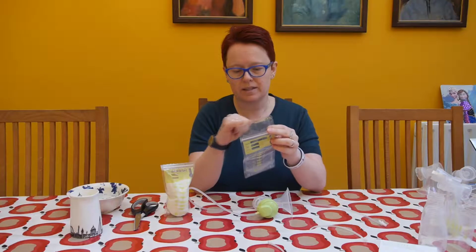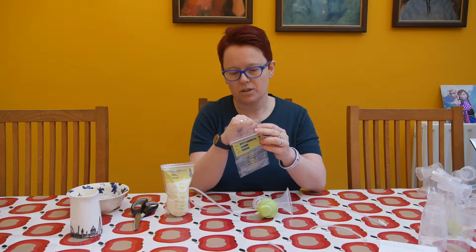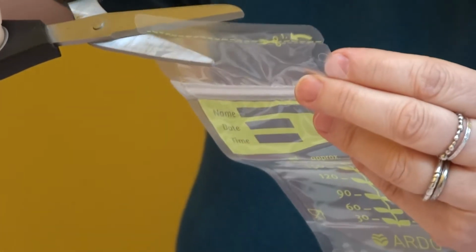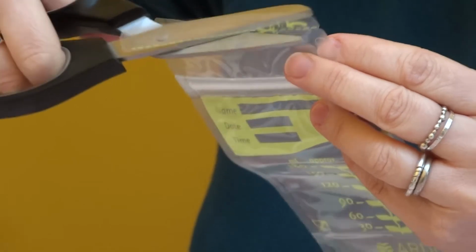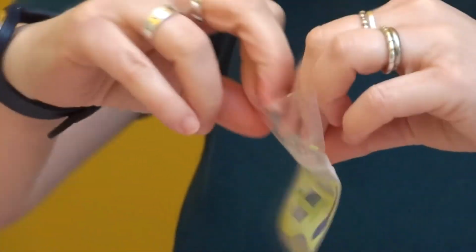We've got two places where we're going to need to do some cutting. The first one is where we've got a number 1 with a dotty line and some scissors. Now we want to do this quite carefully because we want to keep all this space in order to put it onto the bottom of the breast shell. We don't want to lose any of that space.